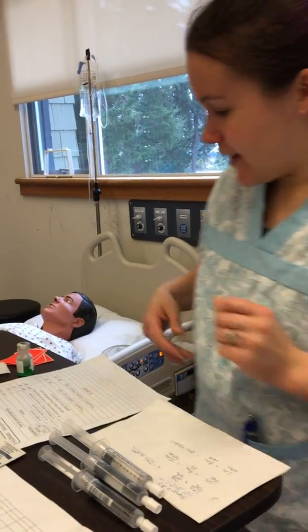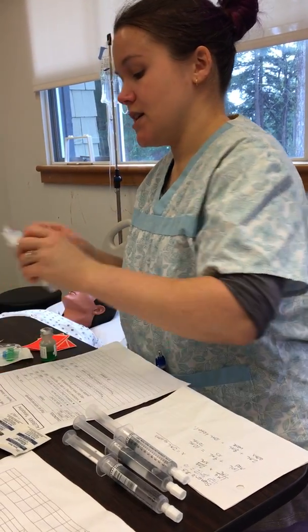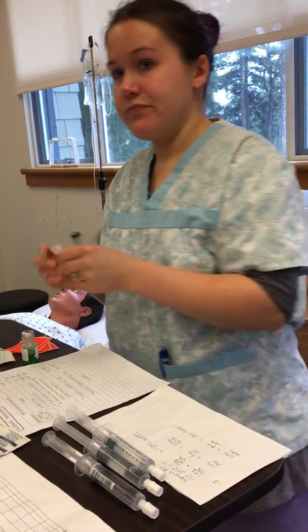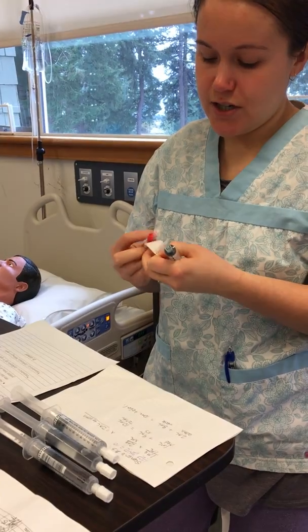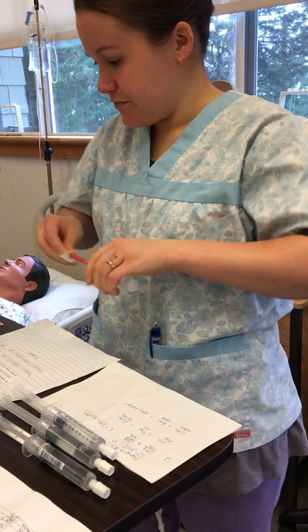Okay. Now that I've cleaned that for 15 seconds or snapped it, I need to take my syringe, attach it to a needle, use a no-touch technique to keep it sterile.